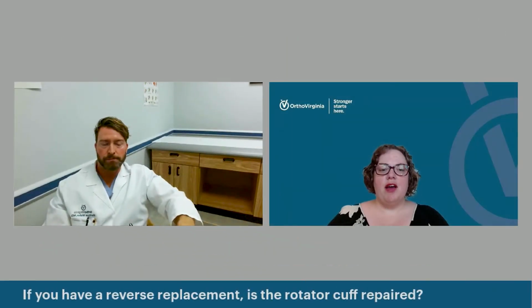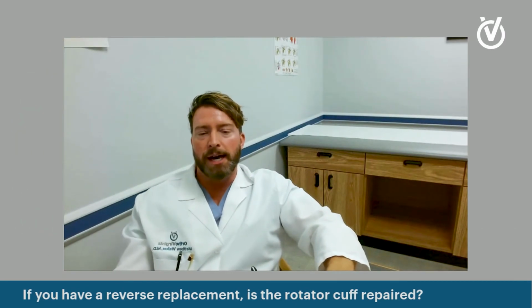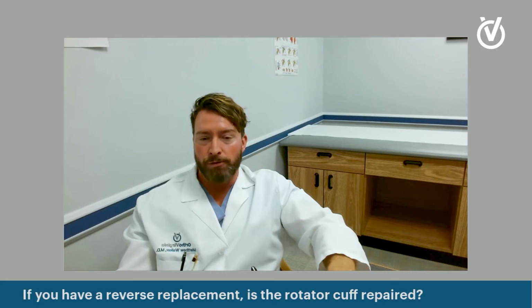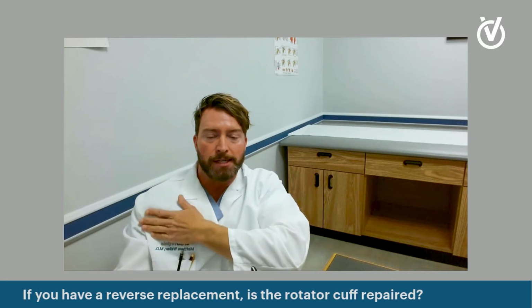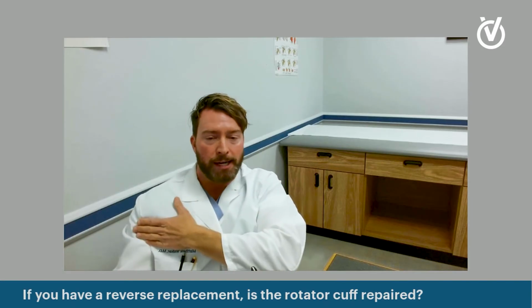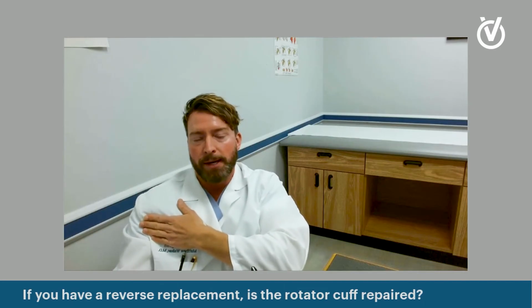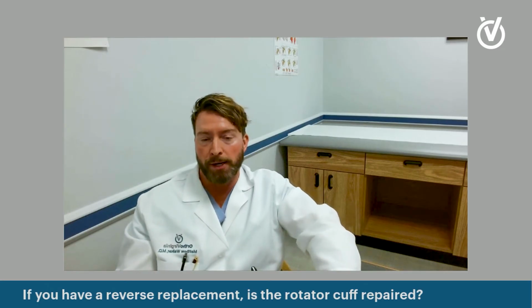If you have a reverse replacement, is the rotator cuff repaired? Yeah, this is, again, not a black and white question. In medicine, there's not a lot of black and white answers, but sometimes when you get a reverse replacement, the subscapularis, or the front rotator cuff tendon, is in very good shape. I move that tendon and I repair it at the end of the reverse replacement if the subscapularis is in good shape and it can reach the right position where I want it to be after the repair.